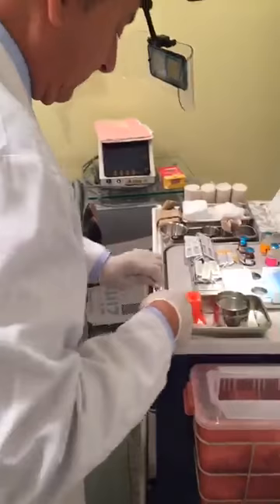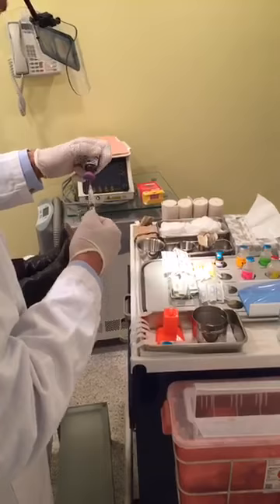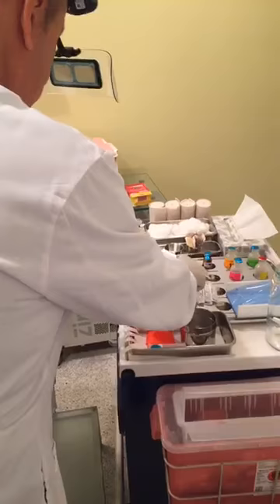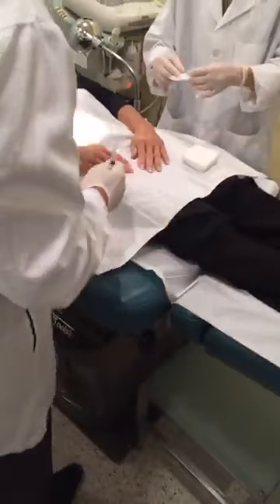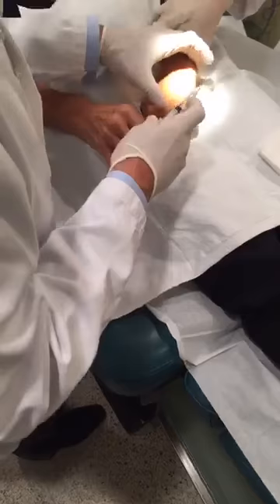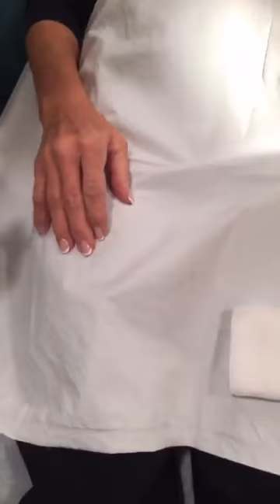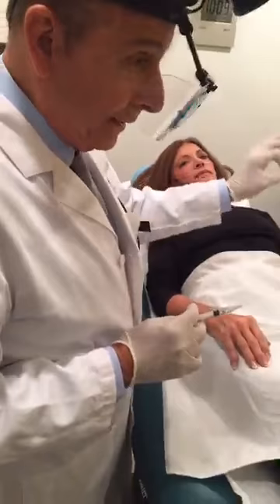I will use a magnifying lens and polarize the light so we can see the vein very clearly. Now we'll use a solution that's typically used for veins. Once the solution is in the vein, gentle fist. Feel the solution going in. Open.